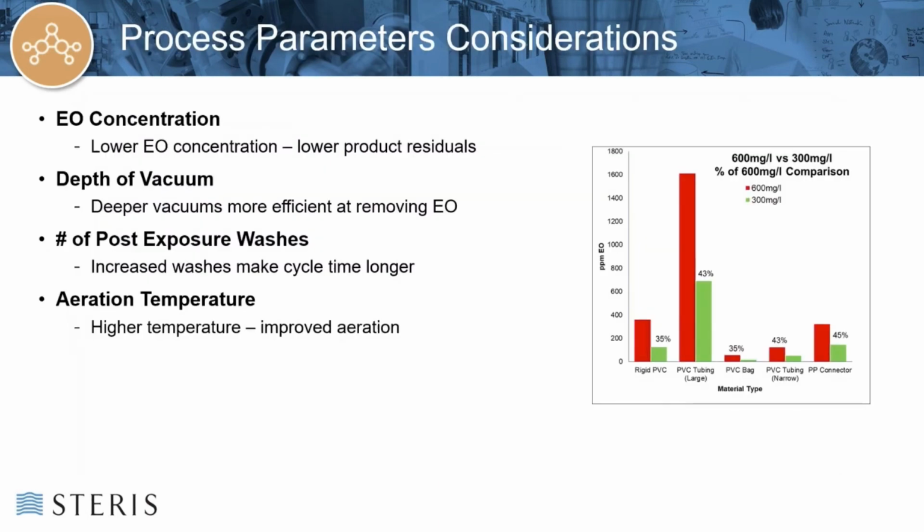There are decisions that can impact residue levels made throughout the development and validation of a device. The type of materials used to make a device can retain residues more or less readily. Glass and metals are known to not retain EO, while plastics are more variable. Bleached papers and chlorinated compounds could impact ECH or ethylene chlorohydrin residues. Product design can also impact residues. Long, small lumens, dead ends, or voids can hold residues.